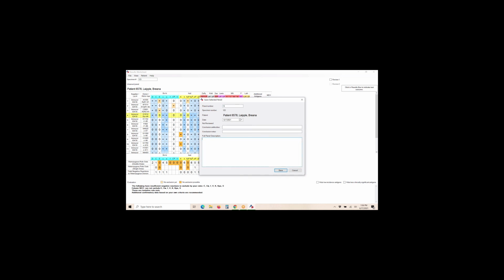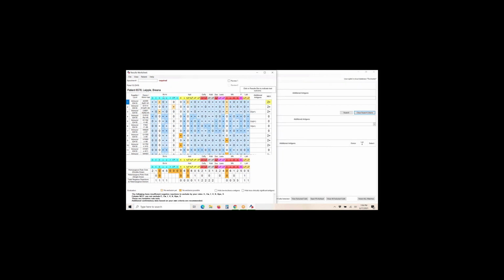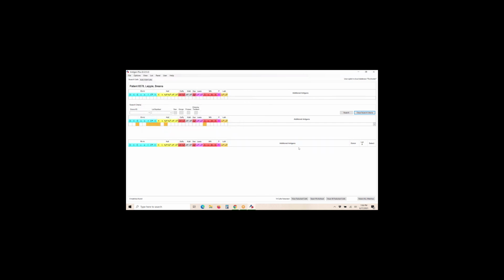And we're just going to save it as ID 416. Alex, are you going to merge it now, or are you going to merge all 3 together? No, I'm going to merge it first. Okay. Because that's how we would normally do it. So yeah, I'm going to merge it. If that's fine with you, that's what I plan to do. Yeah. I was just making sure I was on the same page.